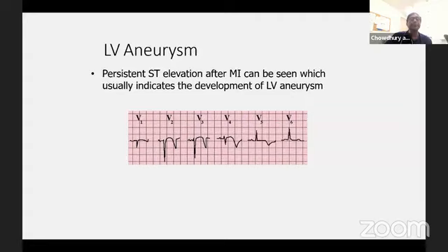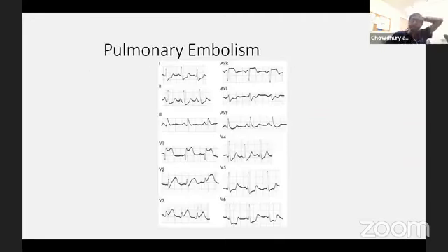Patient with old CABG and this kind of EKG and niggly chest pain, we really need to think about LV aneurysm, which can give you a persistent LV aneurysmal picture in the EKG and very big pathological Q wave. And please do not give lytics right away, because you can be fooled.